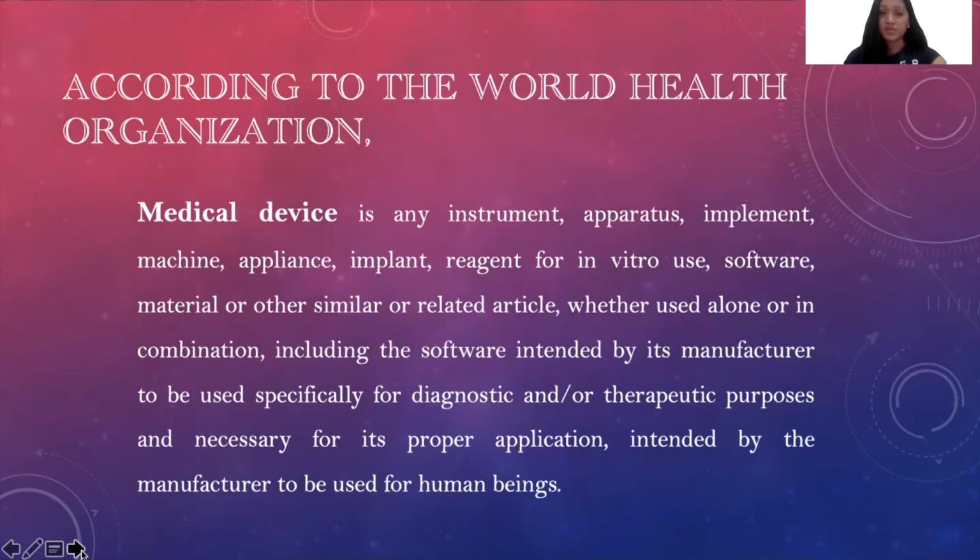These devices are to be used or to aid for the purpose of diagnosis, prevention, monitoring, treatment, or alleviation of disease, and even for investigations.